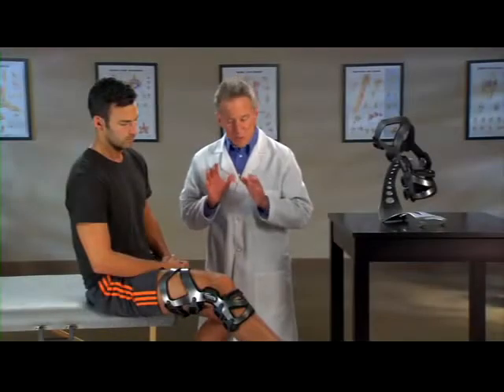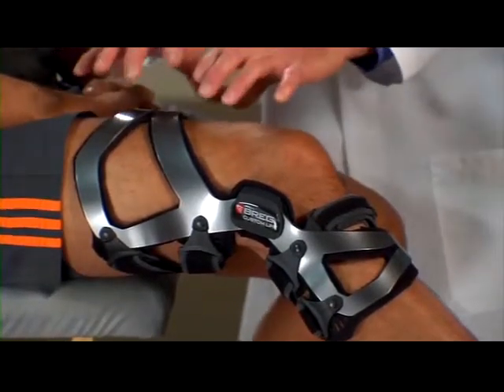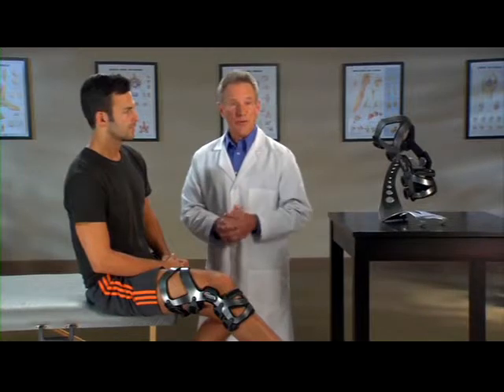Second, the brace works with your anatomy. See this large opening in the front? This is to accommodate your thigh muscle. LPR doesn't interfere with this major muscle, so you're free to move unencumbered.